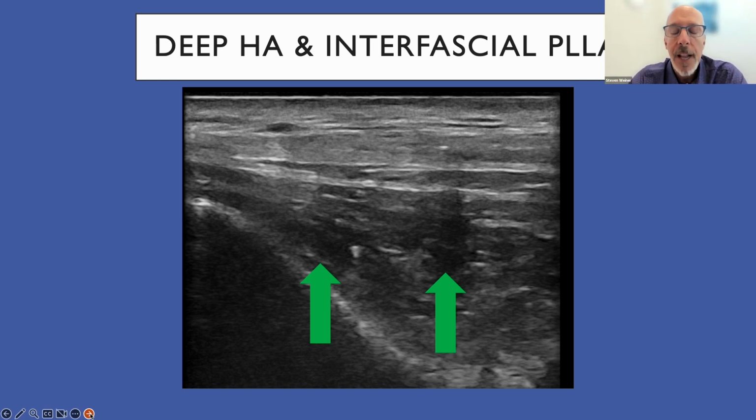From Dr. Swift, I think he said around a needle, you get around a 30, 35% larger hole. And around a cannula, you actually get something around a 70% larger hole. So you're going to get more backflow with a cannula than with a needle. So anyways, those are what HA looks like, and they're in the temporalis muscle.